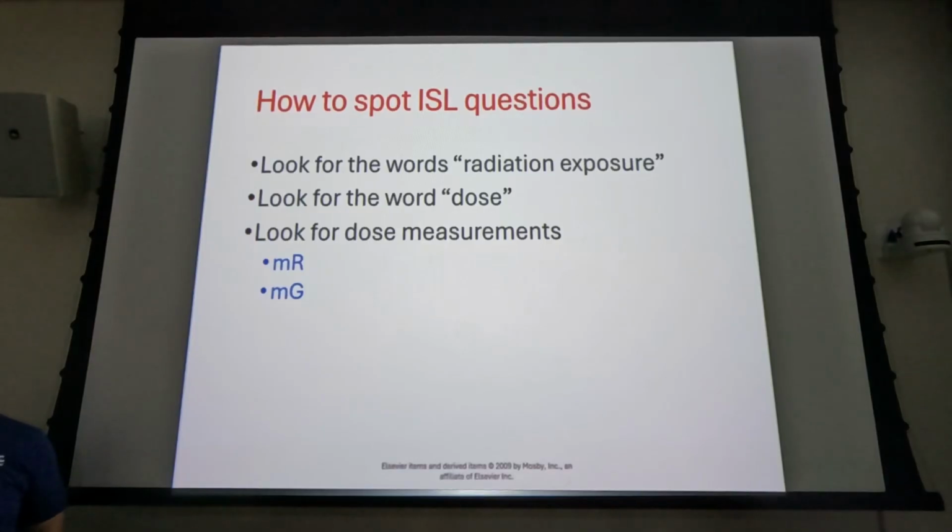The inverse square law may be 1 foot, 2 foot. So in practice, how do you use the inverse square law? You're not really going to work it out, but considering what the inverse square law says, how do you use that in clinical practice? If you need to increase your SID, you have to compensate. Okay, that would be the direct square law.